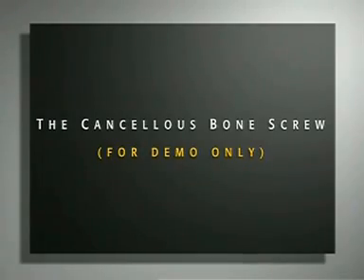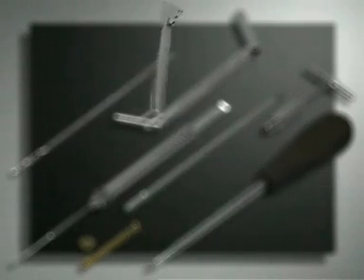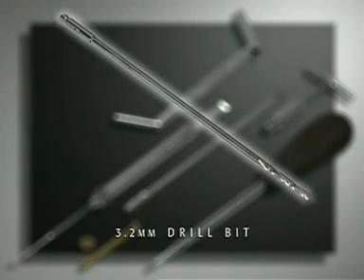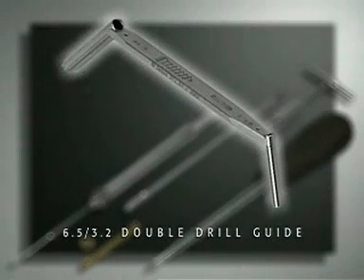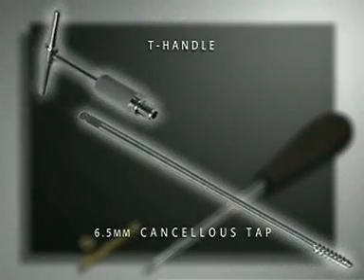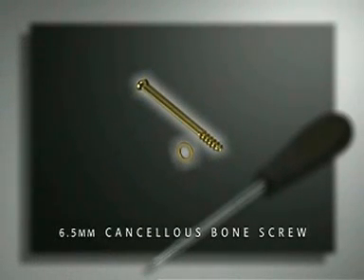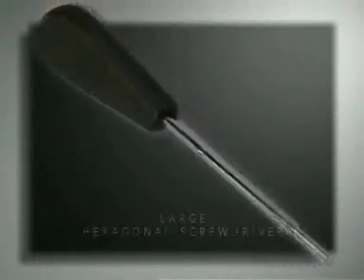The cancellous bone screw. The 6.5 millimeter cancellous bone screw is used to demonstrate interfragmentary compression of a medial tibial head fracture with a lag screw. The following instruments are required: a 1.6 millimeter K-wire with the 2.0 triple drill guide, the 3.2 millimeter drill bit (which has the same diameter as the core of the screw), the 6.5/3.2 double drill guide, the depth gauge, the 6.5 millimeter cancellous bone tap along with the T-handle, and a 6.5 millimeter cancellous bone screw with a 16 millimeter long thread, a washer, and the large hexagonal screwdriver.